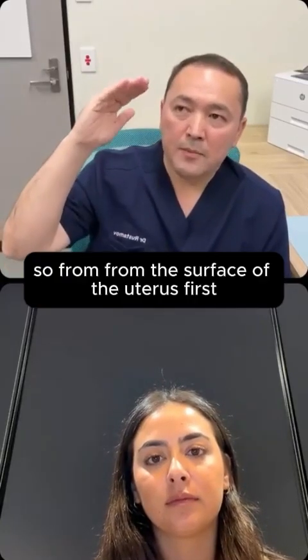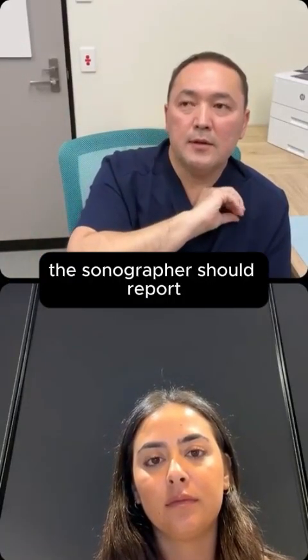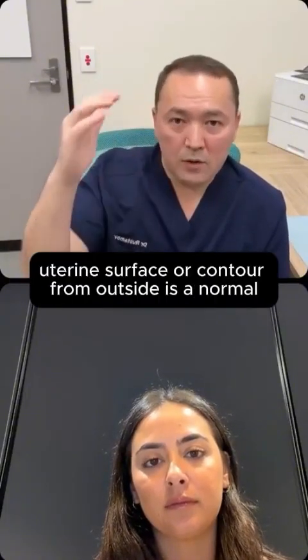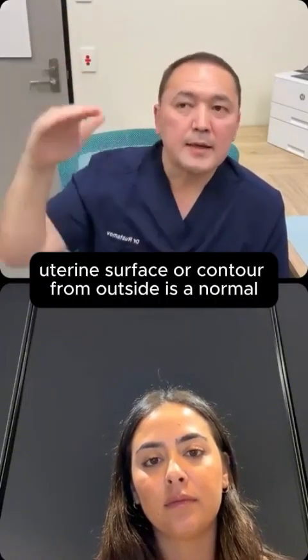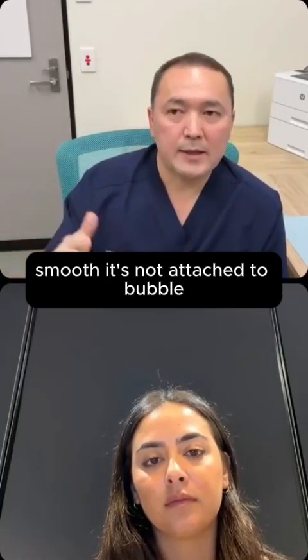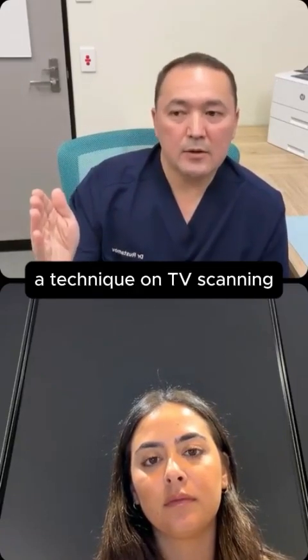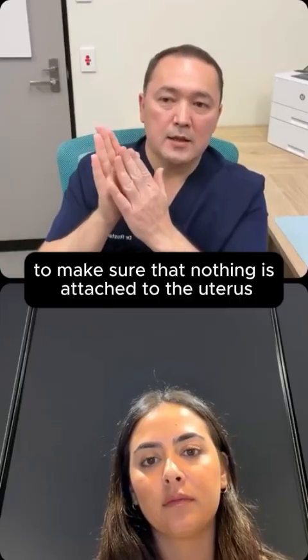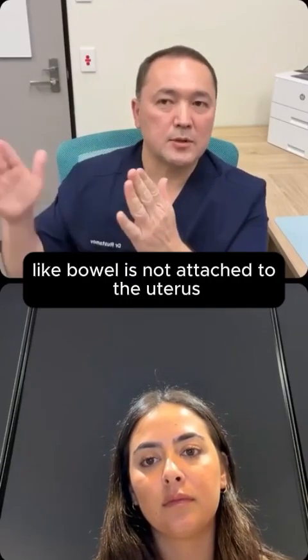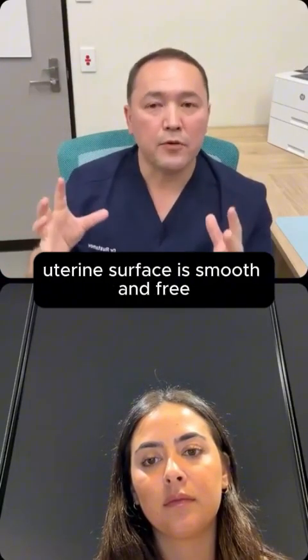From the surface of the uterus, first the sonographer should report the surface or contour from outside, saying it is normal and smooth. It's not attached to bowel. They can use different techniques, like the sliding technique on transvaginal scanning, to make sure that nothing is attached to the uterus: bowel is not attached to the uterus, bladder is not attached to the uterus. The uterine surface is smooth and free.